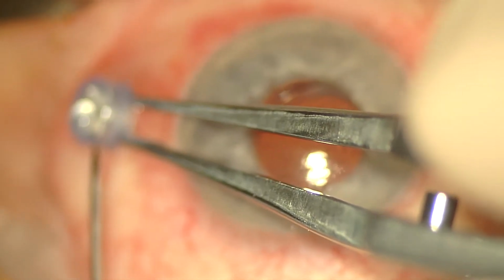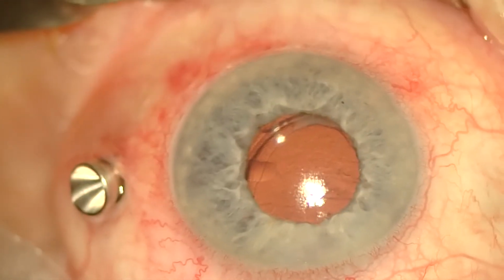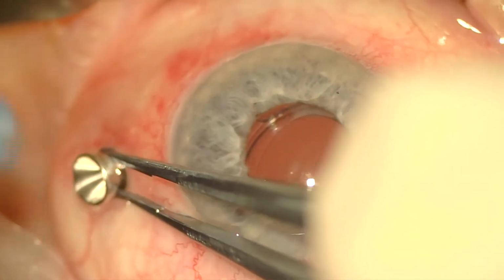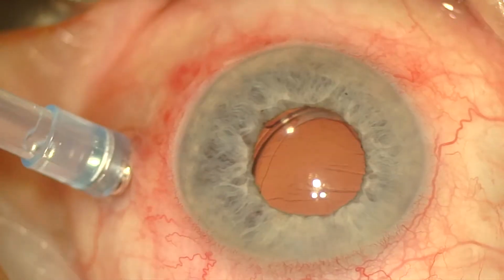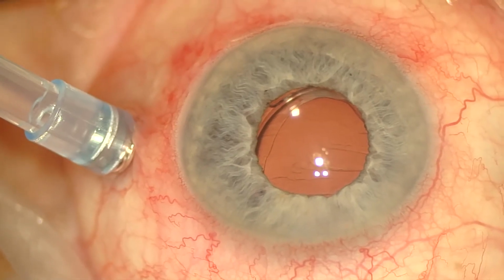The history of this patient was a phaco combined with vitrectomy and inverted ILM flap. After that, a free flap was also done, but the macular hole is still open. We were thinking about doing something different according to the literature. So we are presenting a case of autologous retinal transplant.